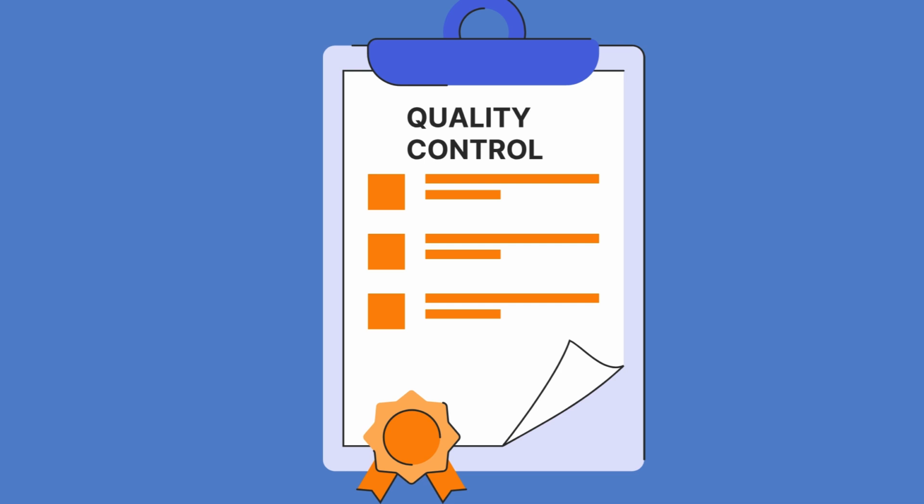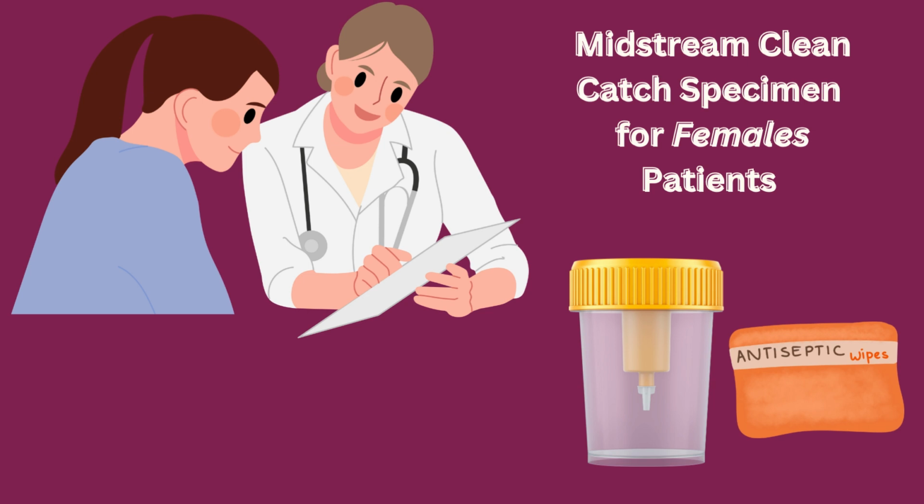In case the test is not working, they will discard this kit and get a new one, making sure that it's airtight and kept in a very dry and dark place as well.